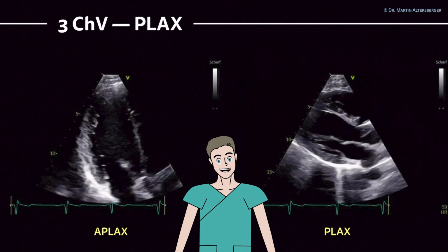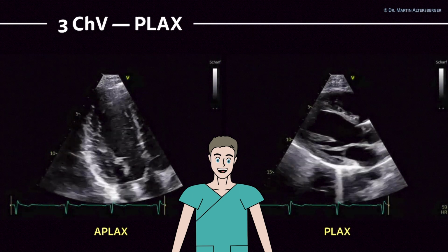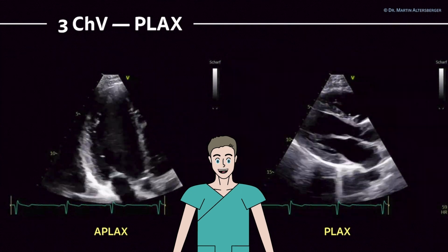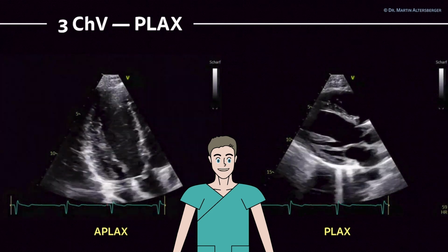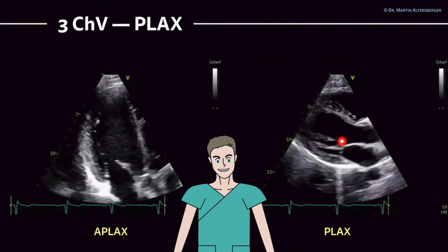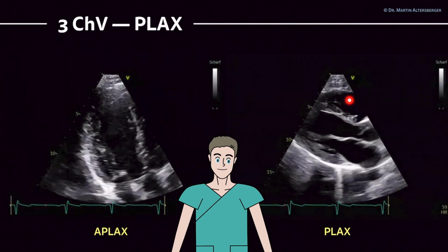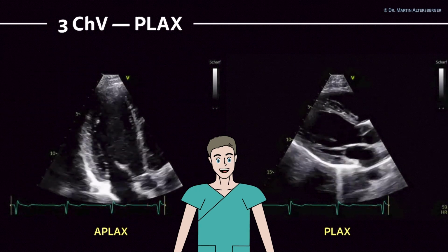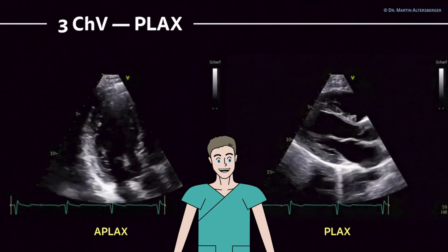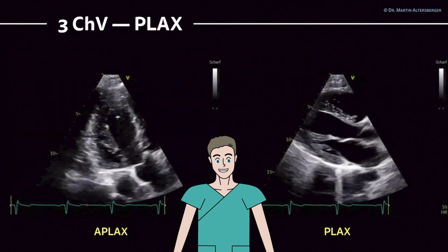Here you have the apical long axis with the mitral valve, the anterior and the posterior mitral valve leaflet, the aortic valve, aorta ascendens, the right ventricle, parts of the tricuspid valve, the left ventricle, the left atrium. And here you see the left ventricle, the left atrium, the mitral valve, anterior, posterior mitral valve leaflet, aortic valve, the LVOT, here the right ventricle. So it's actually the same you can see in those images, just a different angulation and different focuses you are looking at the structures.